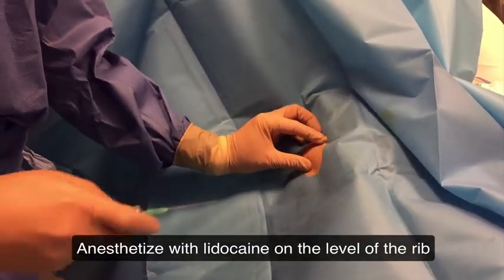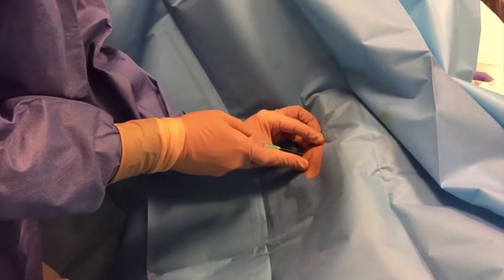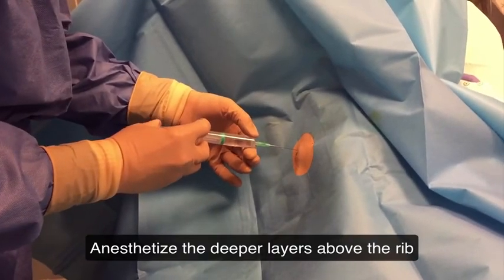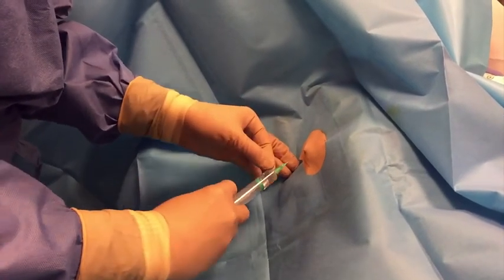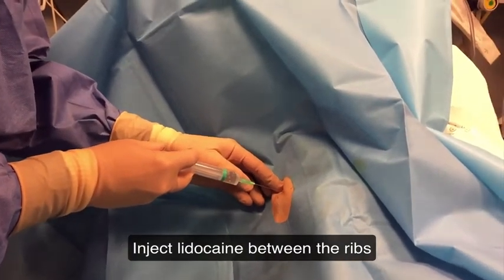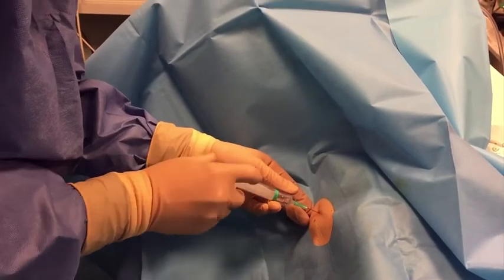Anesthetize the skin covering the rib that you're using as a reference. Now anesthetize the deeper layers above the rib. Then infiltrate the intercostal muscles until you enter the thoracic cavity with a needle.